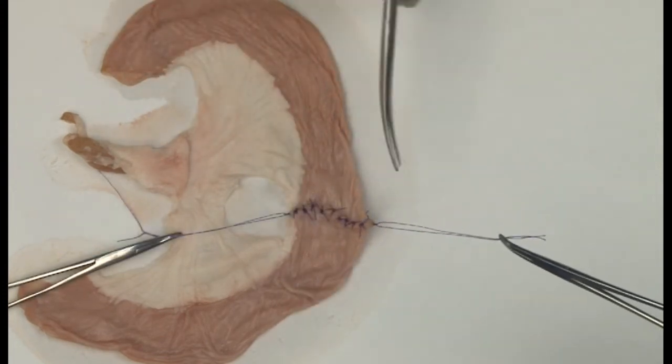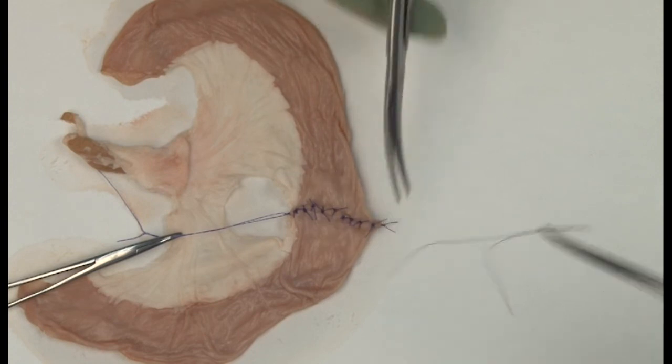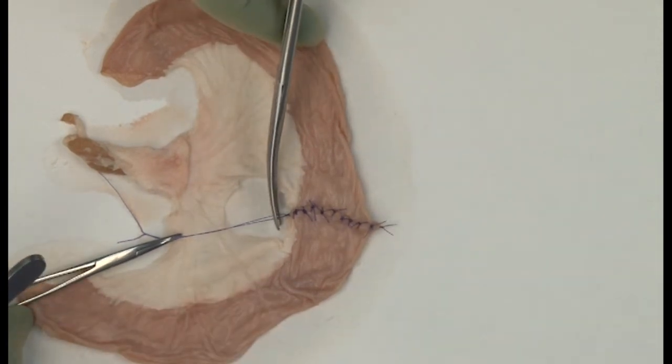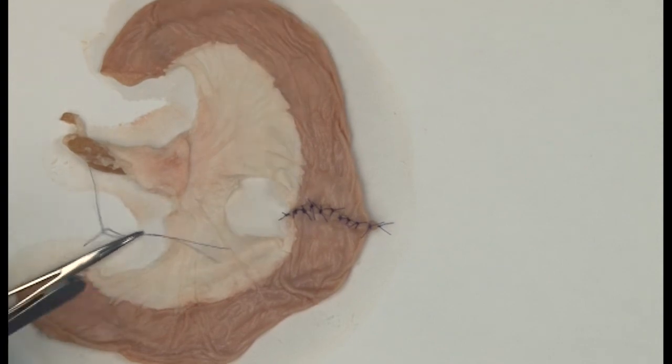If the stay sutures are still untied, tie them now and they can then be cut.